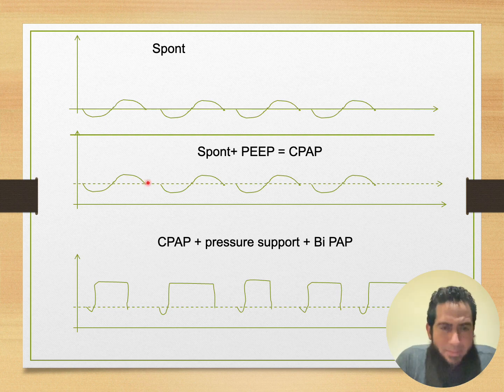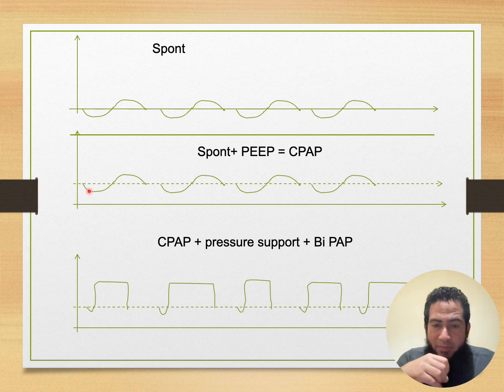So basically, that means that when the patient starts to breathe out on the ventilator or the non-invasive machine, when the pressure reaches, for example, positive 5, if you set the PEEP to be 5, with breathing out, the pressure will initially go up and start to come down.